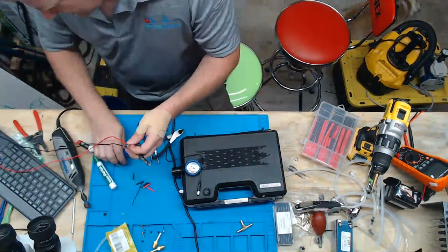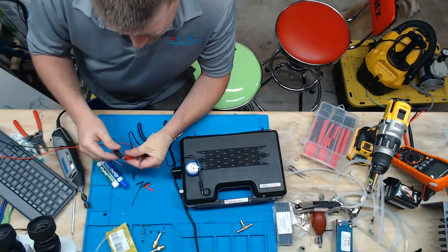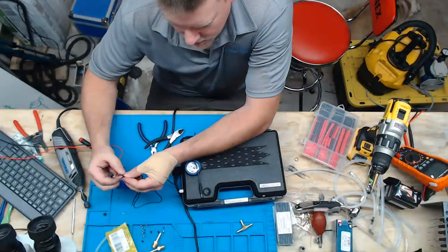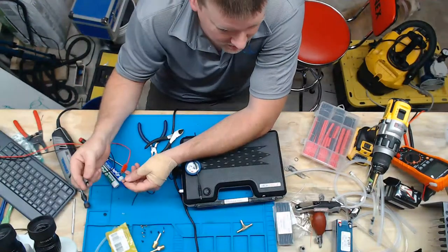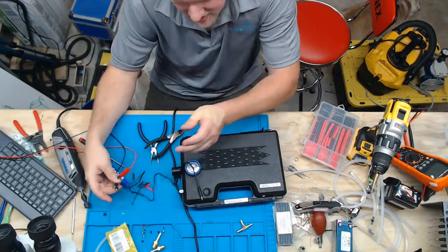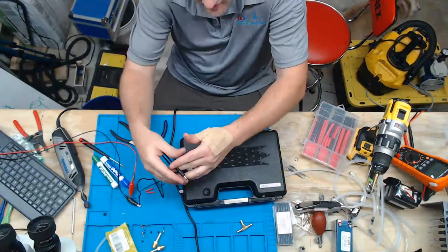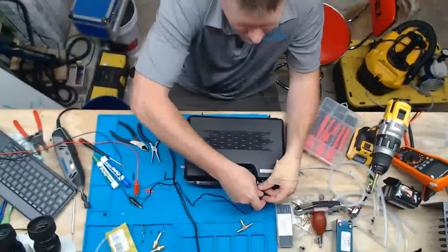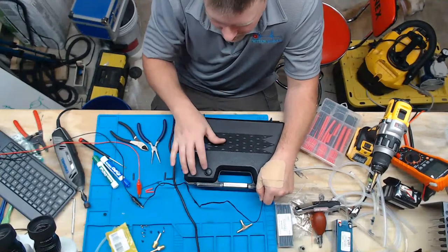So here I've got it set currently at 5.5 volts and 2 amps of power. That should be good. So there is a diode on my larger pump, so polarity does matter. And I know some pumps it wouldn't matter because as it rotates, it's going to work whether it's going this direction or this direction. It's just designed that way. But because my one pump motor inside does have a diode, polarity does matter, and it is what it is. All right, so let's see. Where's my power port right here? I kind of have to hold it in there to get a good connection because it's not the right one, but you'll get the point.